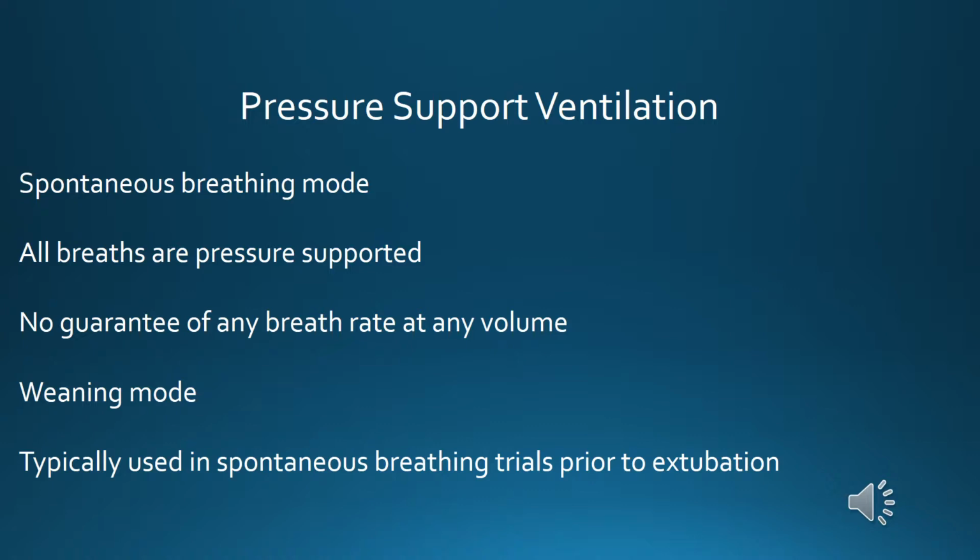Pressure support ventilation, or PSV, this is a totally spontaneous breathing mode. All breaths are pressure supported. Typically, they start that at 10, like we discussed. But you can also reduce that to 5 or 0, and there's even a function on the 840 ventilators by Puritan Bennett called tube compensation, where it calculates the resistance in the inner lumen of the tube and only provides that level of support. So it's like they're breathing without being intubated at all.